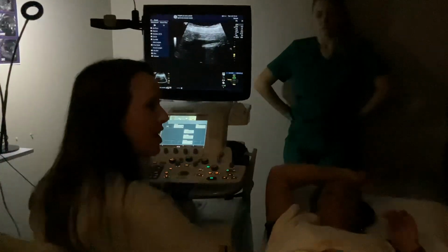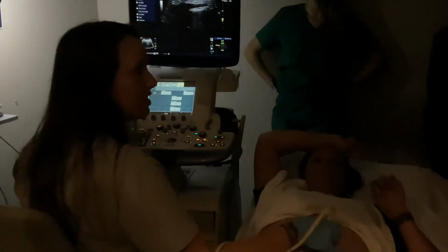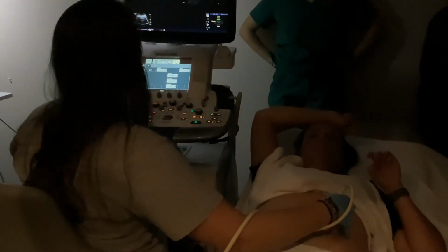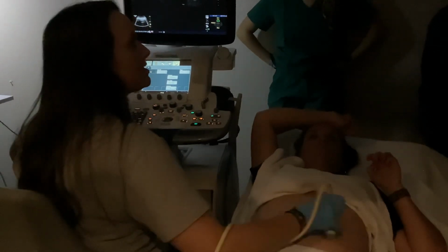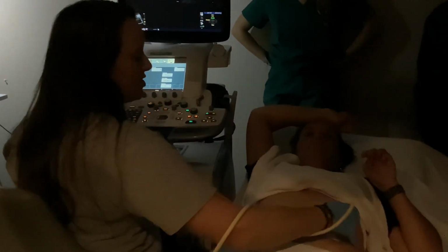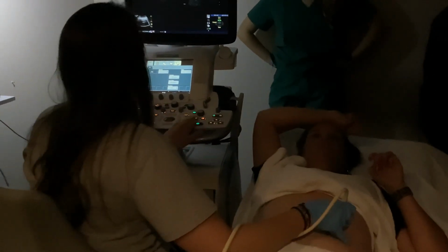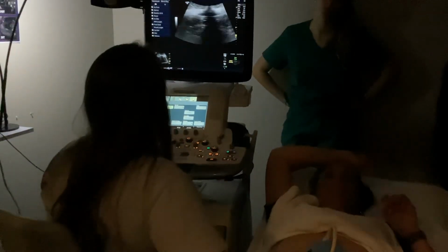So that heel toe action and the angling, you guys all been gone over that? So it's not about necessarily going like this to try and find her iliac, but here and just moving around and how I need to make the image. So those are the iliacs.